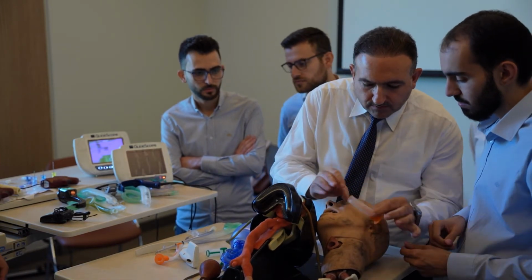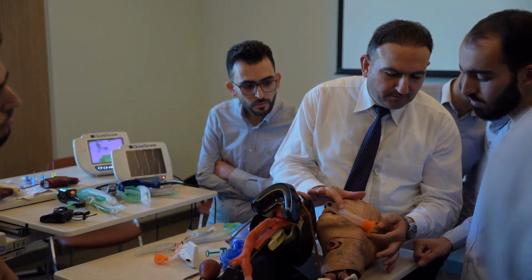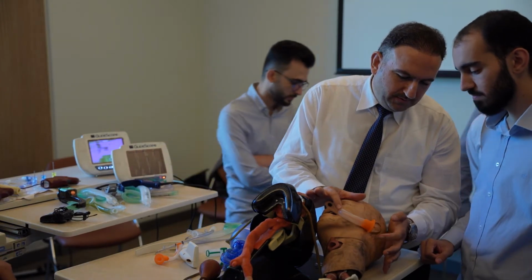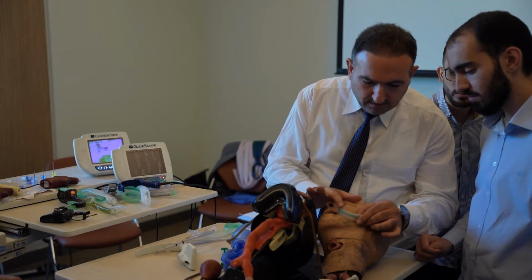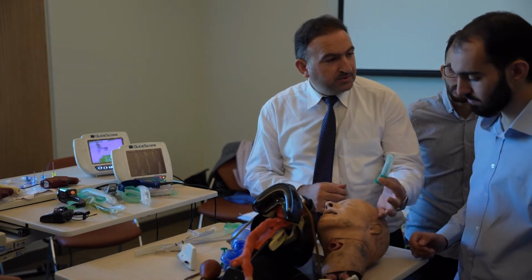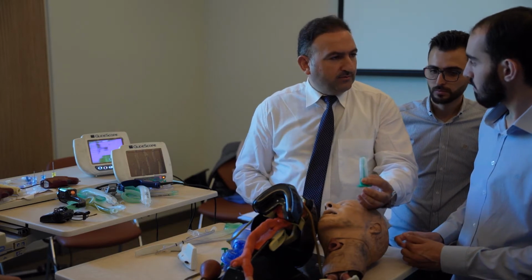Simply measure from the angle of the mouth the other way to the loop of the ear. So if you go that way, this will be okay. That's the same size. If you see this from the angle of the mouth to the loop, this is small. Can you use a small size? If you don't have it, and this is the only oral airway you have, you can put it.